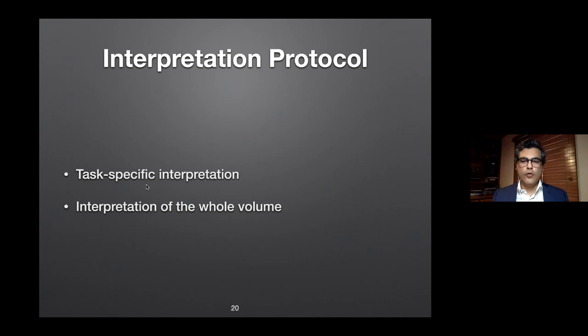And any clinician, these days, if you're not really well-versed in cone beam CT, you need to get yourself acquainted and up to speed with how to view and how to interpret CBCT scans. So the task specific is, for example, in this case, that the prescribing clinician should be able to view the scan and do everything that is required in the process of implant treatment planning. So that's task specific.